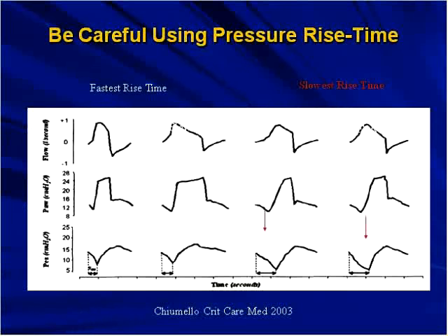Now, pressure rise time is a real nice feature on pressure support and pressure control ventilation, but it has a downside. And I think the upside to it is when you have patients with what I like to call twitchy airways, that you give them a robust breath with a high flow rate, particularly if they have asthma or COPD or Kaposi sarcoma of the airway, you can cause reflexive coughing. So adding a little bit of pressure slope to the breath, okay, can help alleviate that.